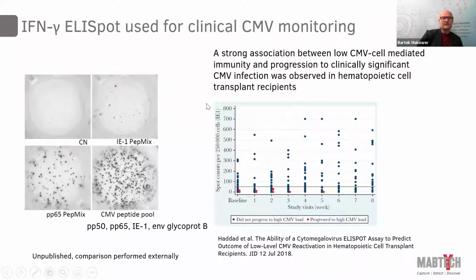On the left, just showing that it's an advantage to mix dominant epitopes from several viral proteins. So this is a peptide pool based on one CMV protein, quite weak response. This is another CMV protein. This protein is actually usually giving a dominant response. But if you use epitopes from 4 different CMV proteins, you get a much higher frequency of response.